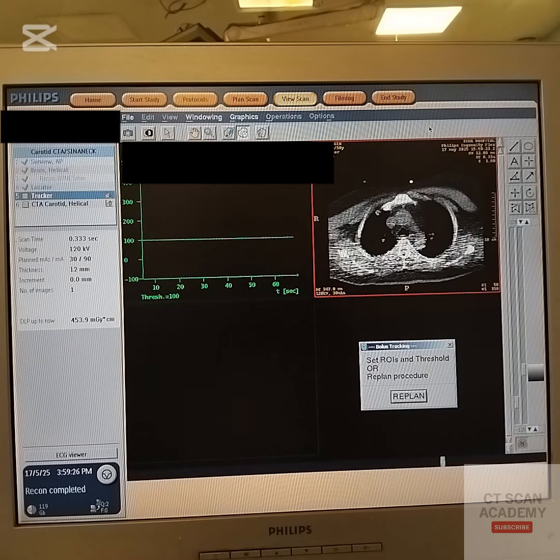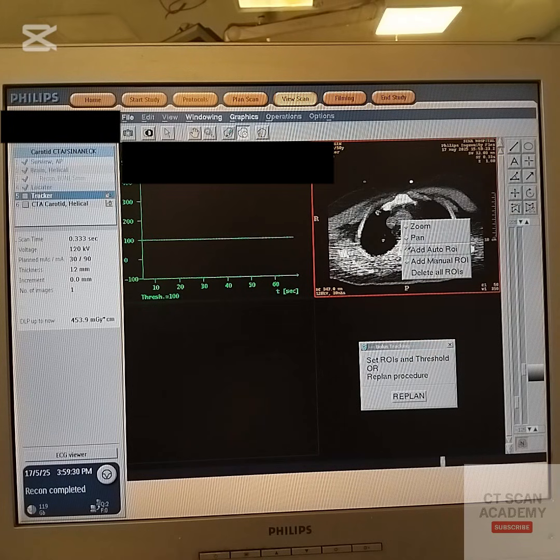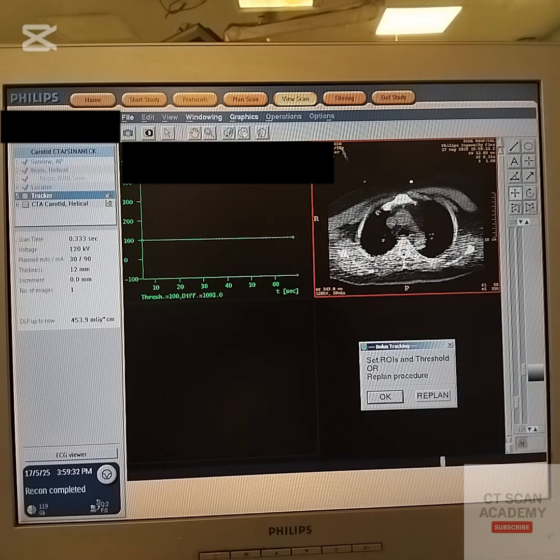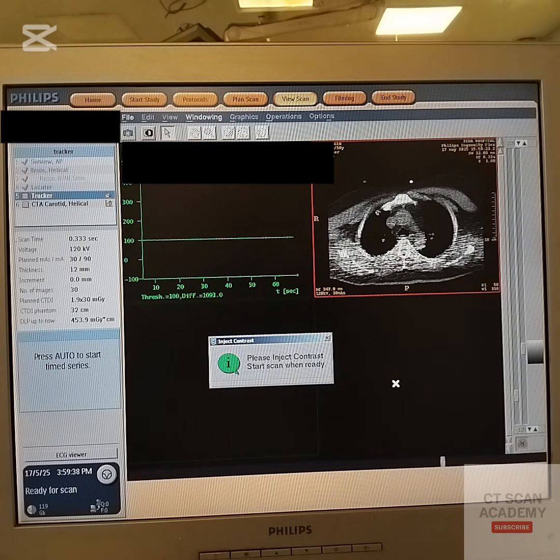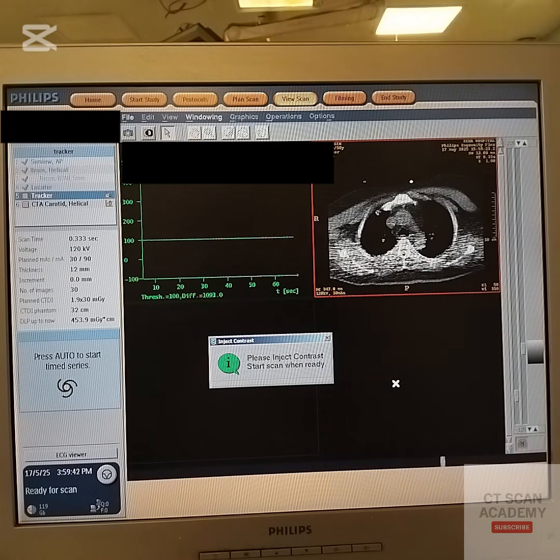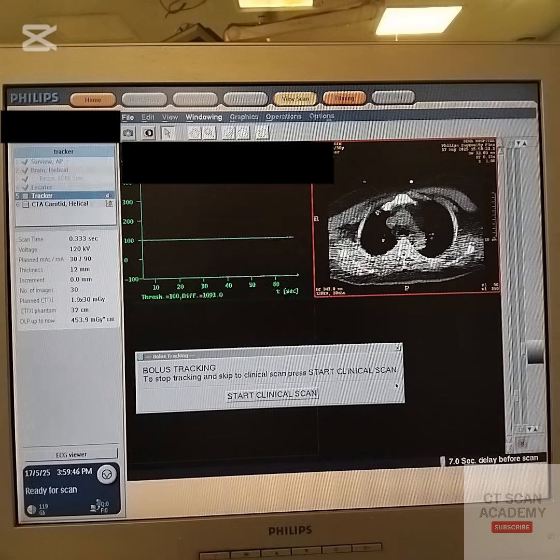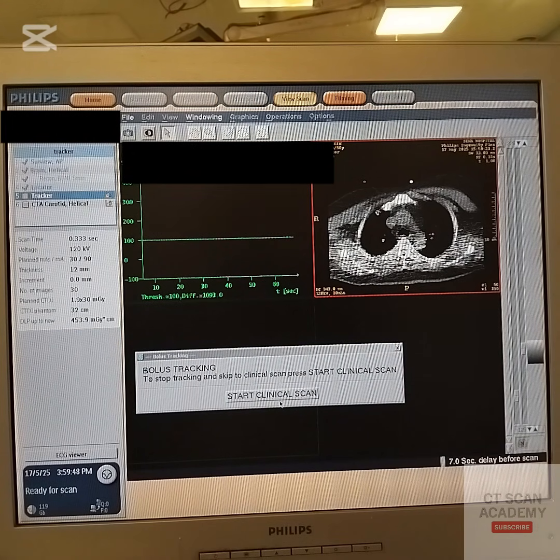Since stroke patients may be unconscious and move unexpectedly, the region of interest, ROI, should be placed outside the body, just outside the aortic arch. This allows for manual triggering based on visual contrast arrival, preventing false region of interest detection if the patient moves. The tracker and main scan are linked. Once the tracker starts, the main scan will follow automatically.